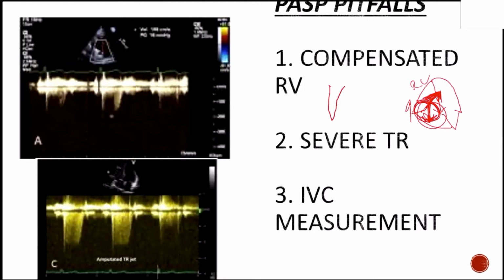Now, do these patients do poorly? Yeah, a lot of them do poorly, right? Because they're pretty sick in general and they have horrible pulmonary hypertension already, and developing pulmonary hypertension is already going to increase your mortality, right? But they're a shining example of if you have very, very severe TR, that the two chambers start to really just look the same, right?